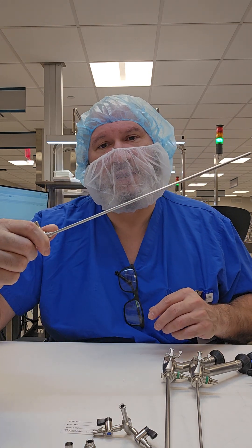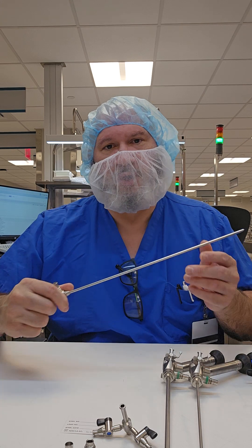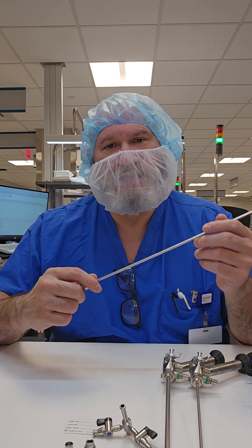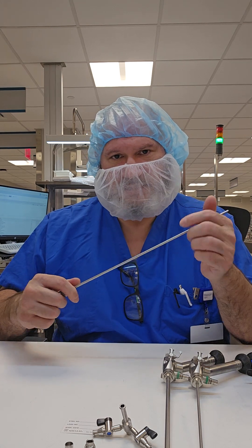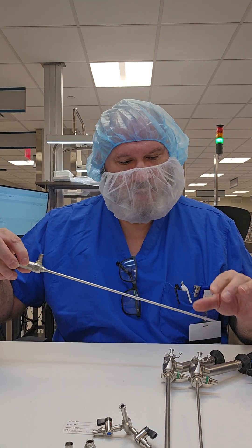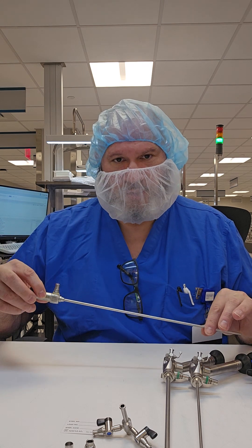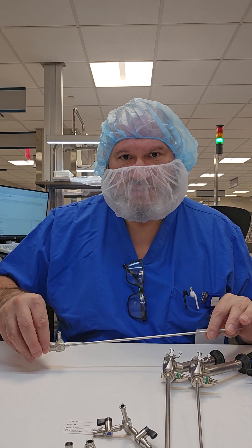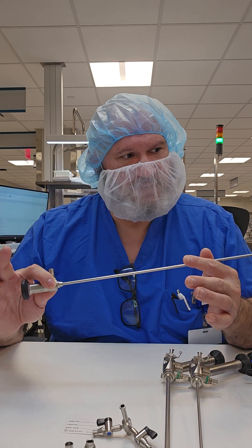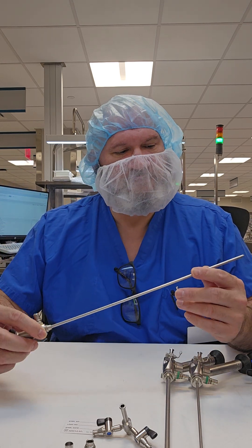This is the proper way to handle a scope. You don't want to wave it around — this is not a magic wand. You want to handle this with two hands as best as possible. When you're placing it into a container, ensure that you secure the distal tip and then push down on the eyepiece and the body to secure it in the holder.